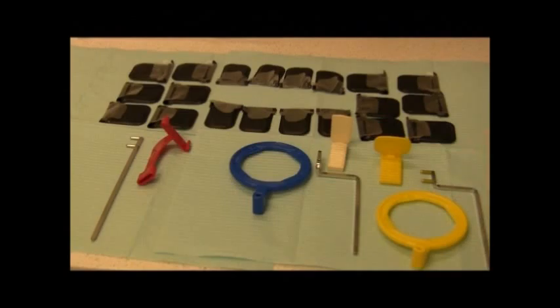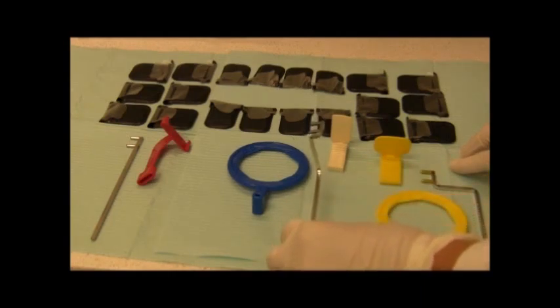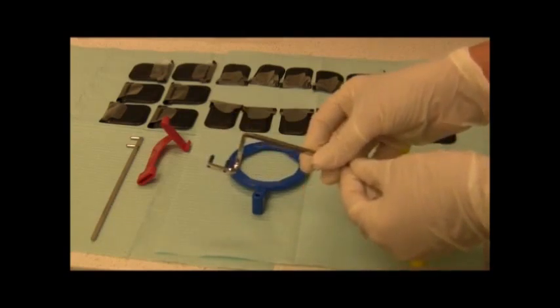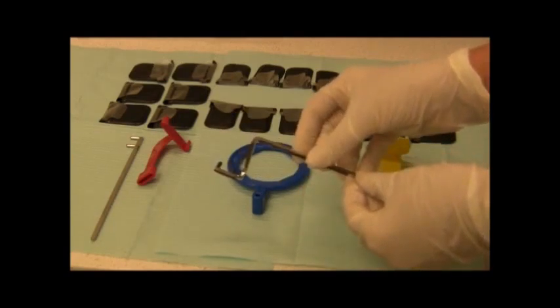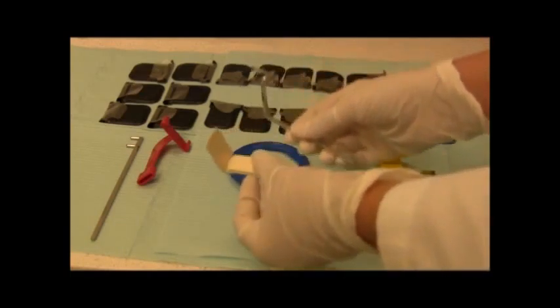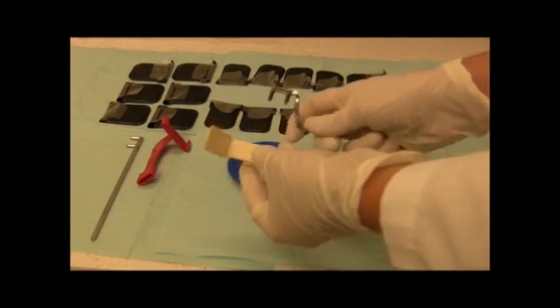Prior to seating your patient, you should go ahead and assemble your Wren instruments. The alignment rod with the most bends is the alignment rod for your upper and lower anterior periapicals. It goes with the bite block with the narrowest width dimension.